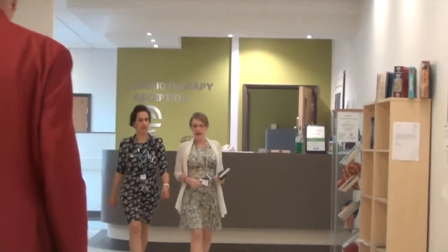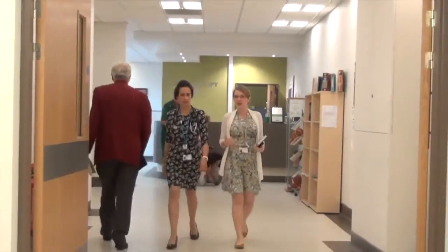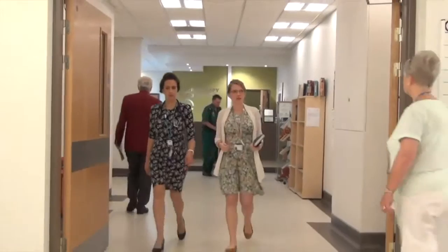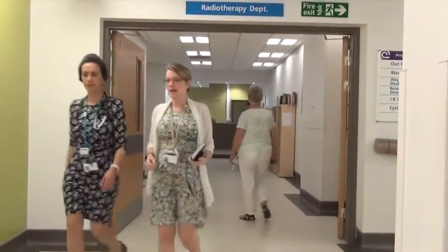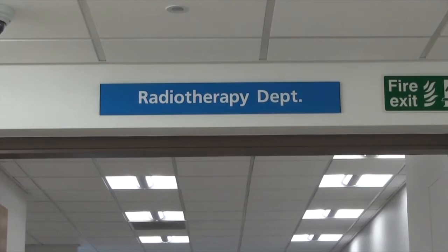Radiation therapy is one of the most common treatments for cancer. In this video we will walk you through the entire radiotherapy process from the planning phase to the final steps. Radiation therapy, or radiotherapy as it's commonly known, uses high-energy x-rays known as radiation beams to destroy and damage cancer cells.